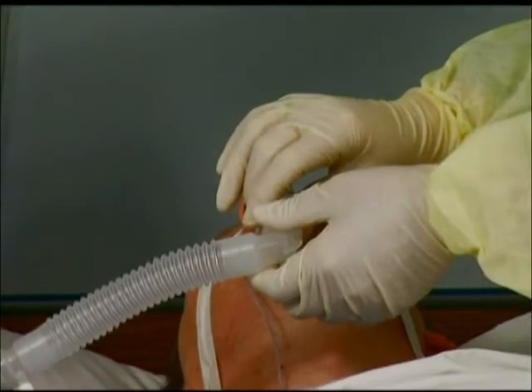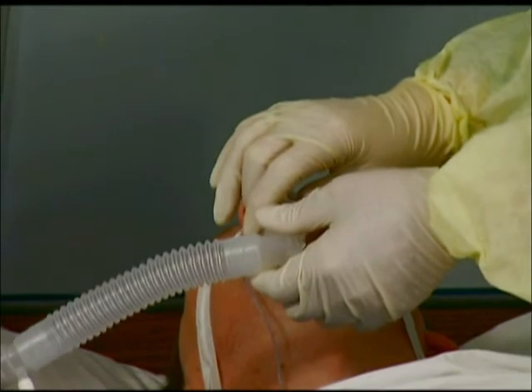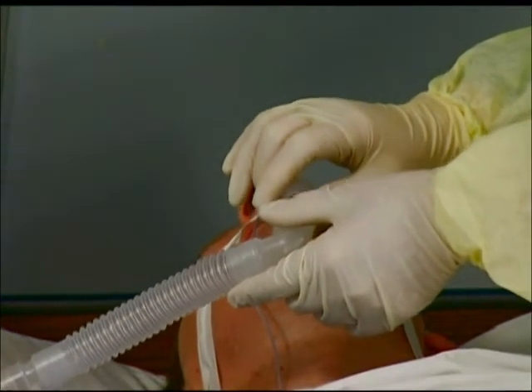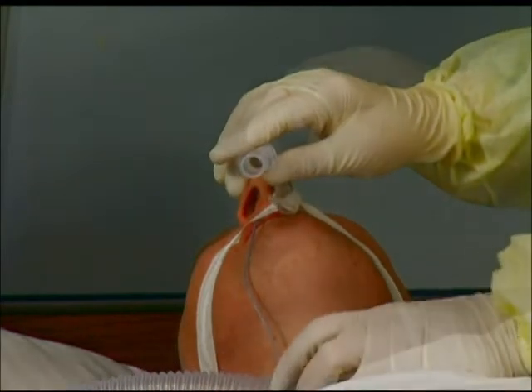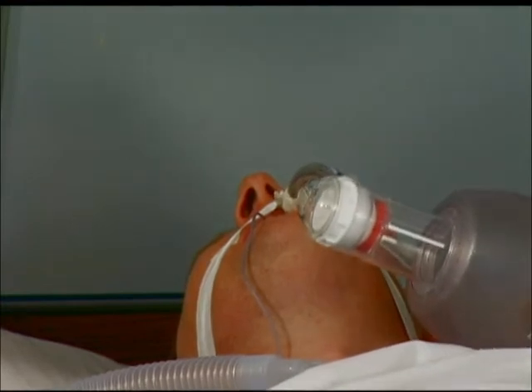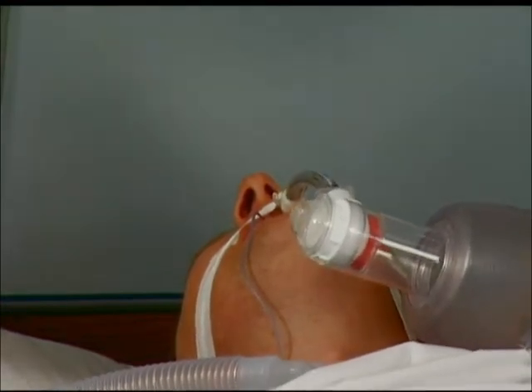Continue to monitor the patient as necessary. Watch for alarms that may indicate dangerous conditions for the patient. If at any time an alarm occurs and the reason is unknown, disconnect the ventilator and provide manual ventilatory support as described in previous modules until help is available. For a complete list of alarm messages, see the ventilator operator's manual.